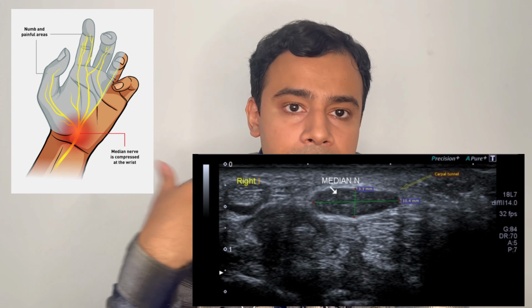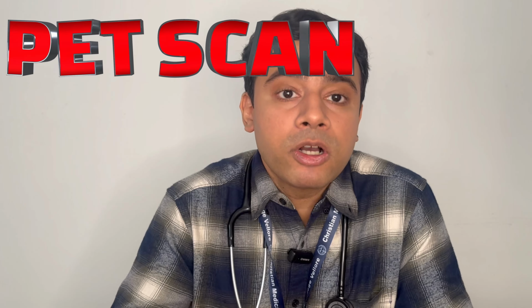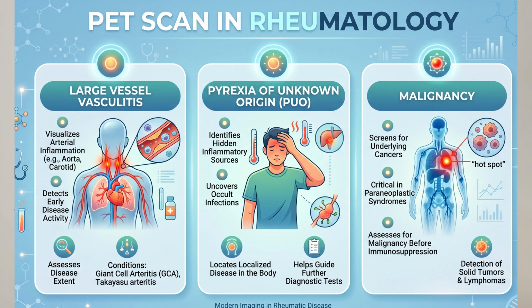Okay, then we have a bit more advanced imaging modalities that we use in some diseases, like your PET scan. PET scan is your positron emission tomography. Okay, so PET CT we use for diagnosis of large vessel vasculitis. Then in the evaluation of PUO, PUO is pyrexia of unknown origin or fever of unknown origin. Okay, then also for diagnosis of underlying malignancy we do use PET CT scan.